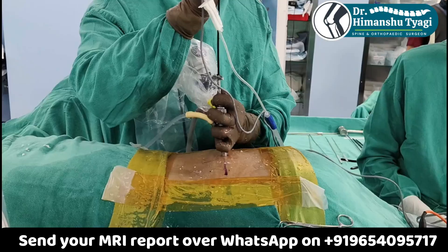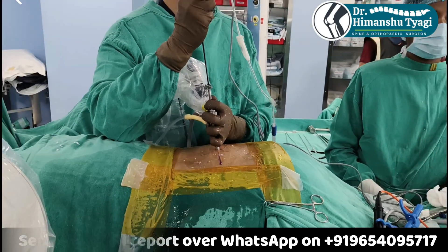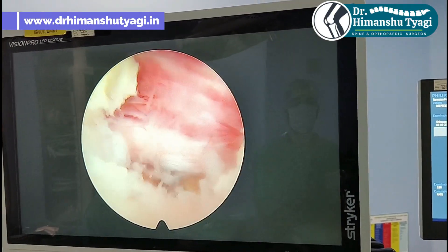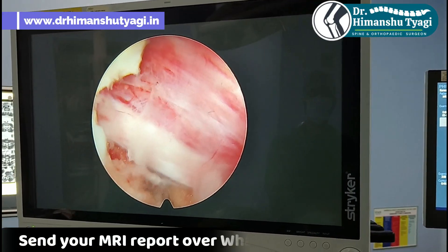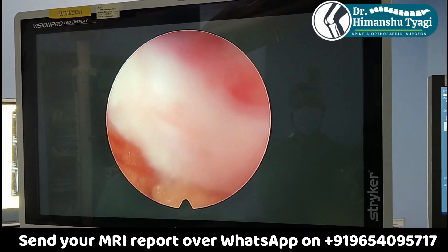We selectively burn that part of the disc — the opening from where the fragment came out — using a special equipment. Here you can see that after the surgery the nerve root is totally free; there is no pressure on the nerve root. It can be visualized throughout its length, and this is the end point of the surgery.